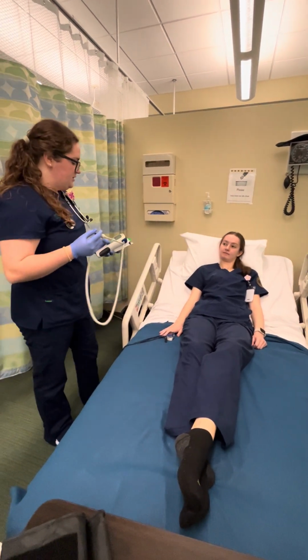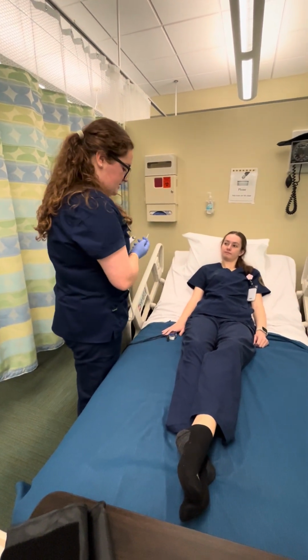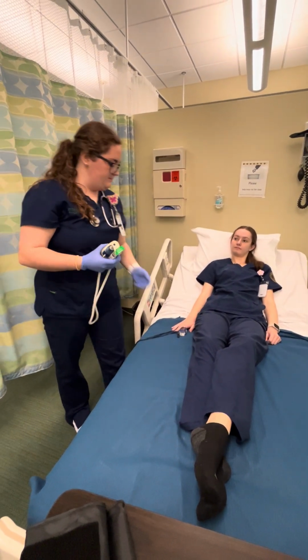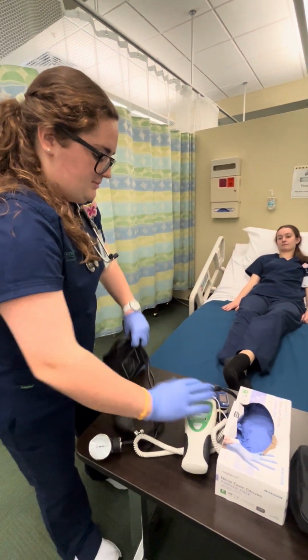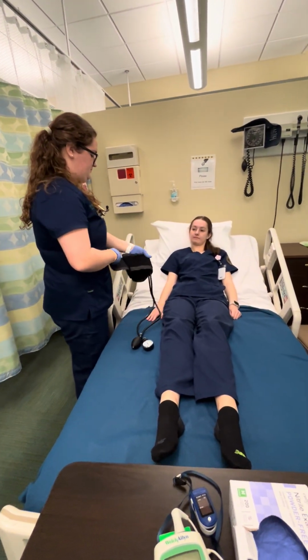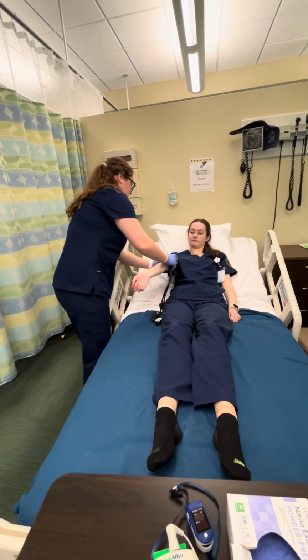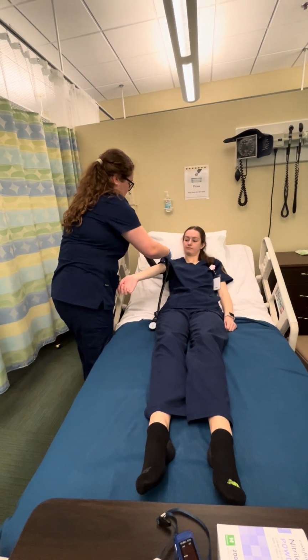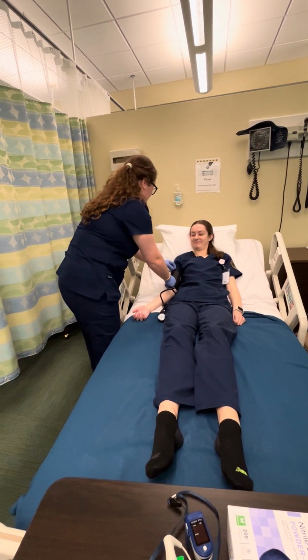Okay, her temperature is 98.6, which is regular. Her O2 saturation is 99%, which is also a normal reading. Next, I'm going to take your blood pressure. Okay, you can rest your arm.